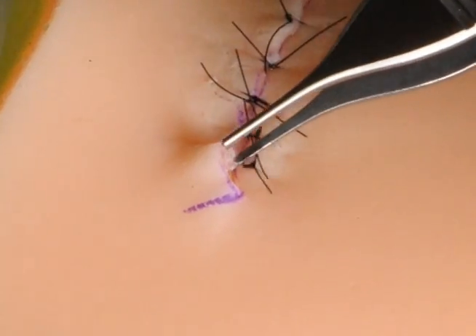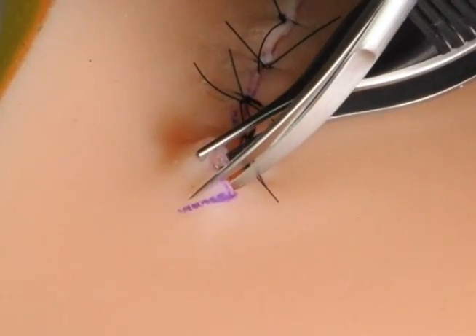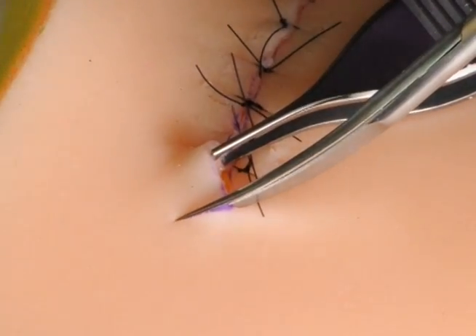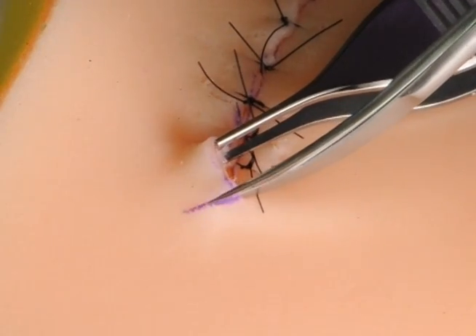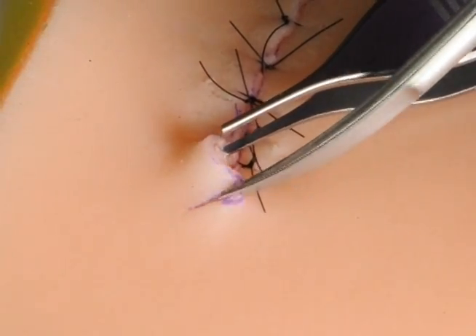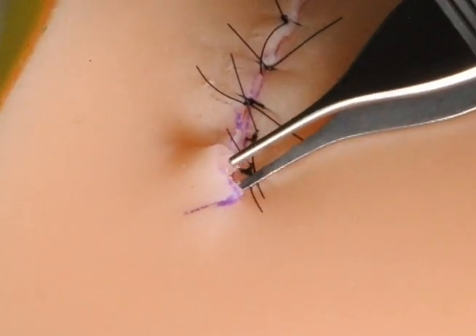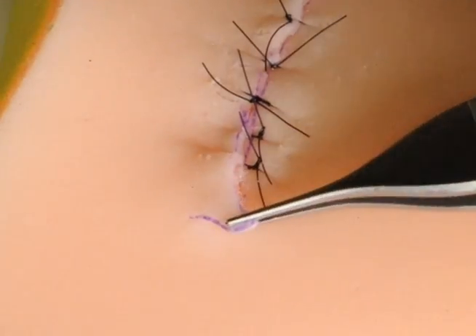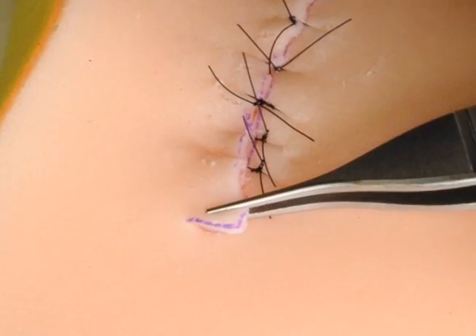Next, using a pair of scissors, you cut along the line to extend the end of the wound. This will leave you with an extra piece of tissue, which you then grasp with forceps and stretch until it lies flat.